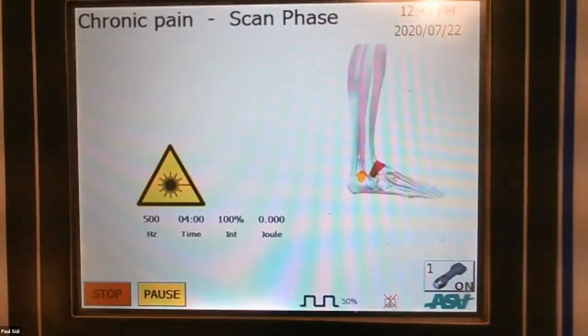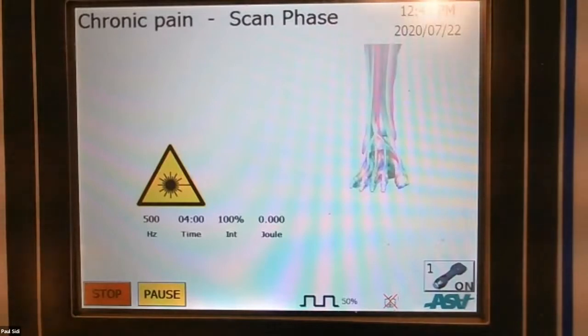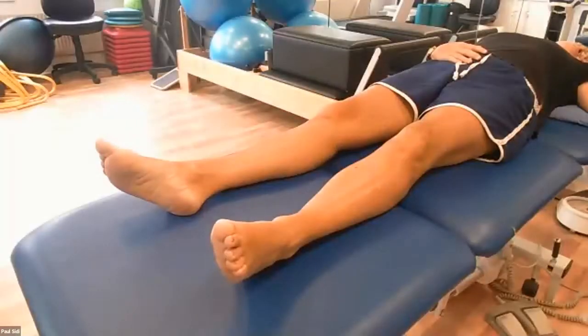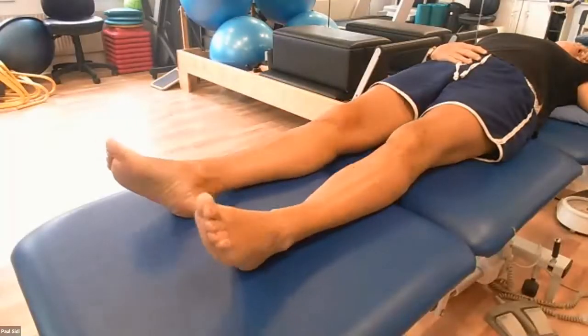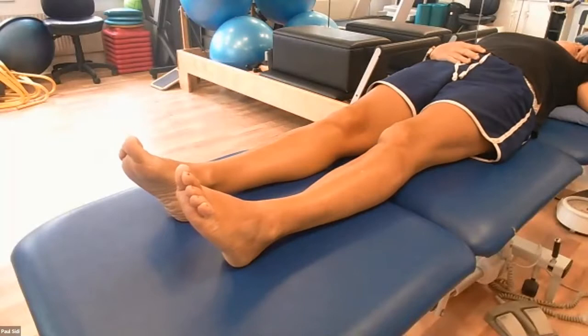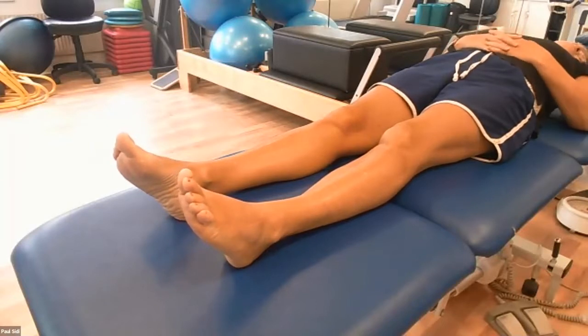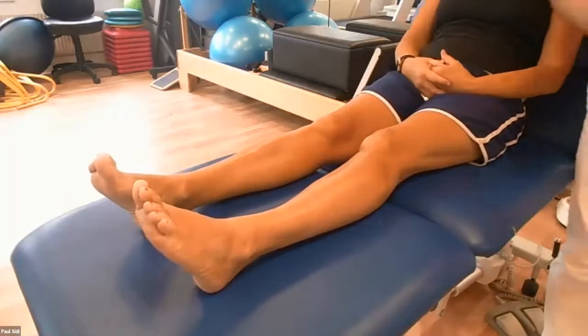I'm going to change the screen, but make sure you put your glasses on because this is infrared light. You will see a red area showing you where it's going, but that is an LED. Infrared light you cannot see. It will bounce off anything metallic, and if it goes into your eye, it will cause you retinal damage. So don't take this lightly. Use the glasses.